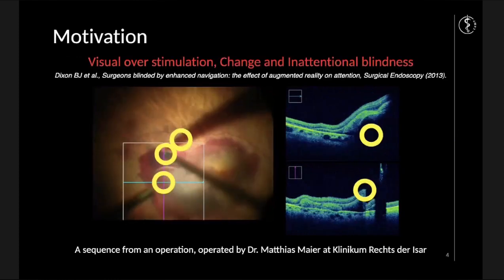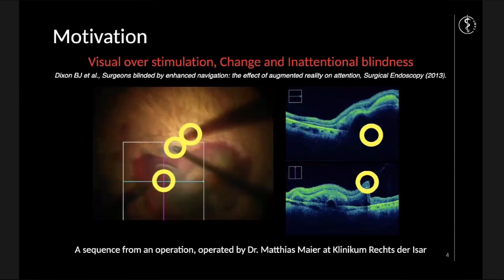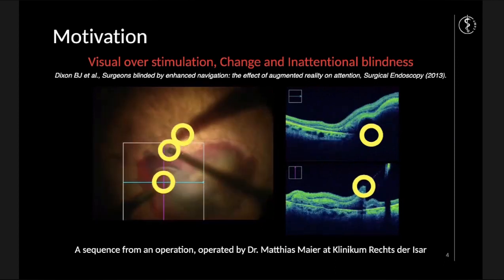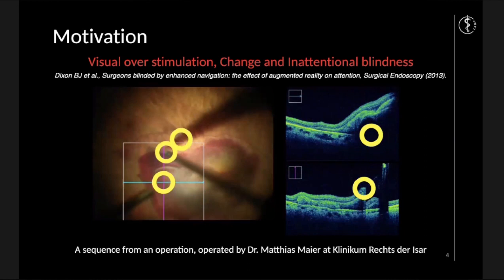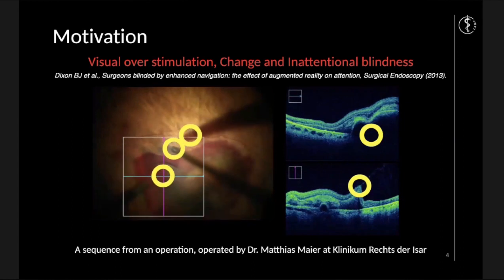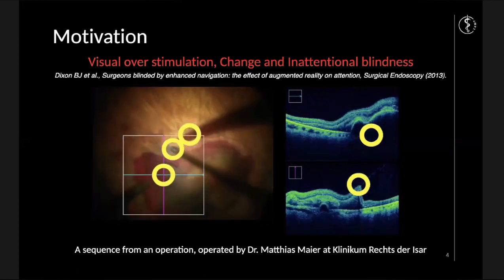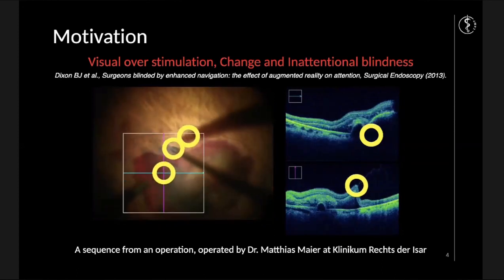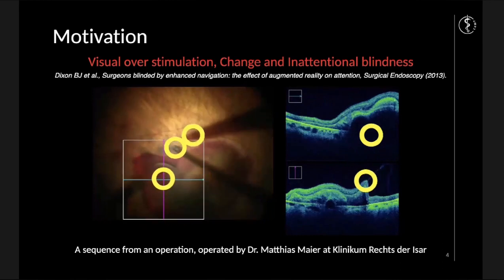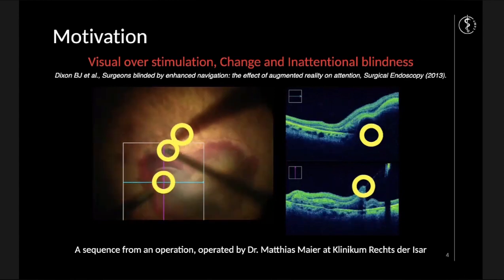In such cases, surgeons are usually interested in following the position and state of even up to 5 points at the same time, which is, even for most experienced surgeons, very challenging and difficult. In most of the cases, surgeons ignore the OCT intraoperatively, which provides very valuable information in the OR, but they prefer to focus on the fundus image as they cannot manage to cover all the visual complexity at micron level.